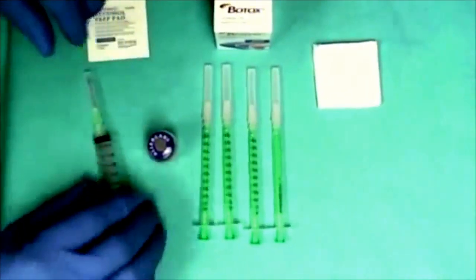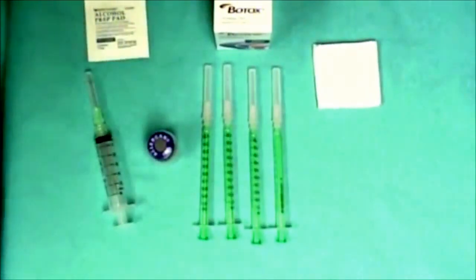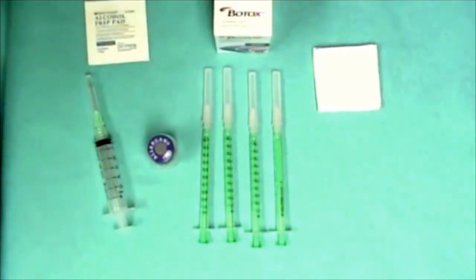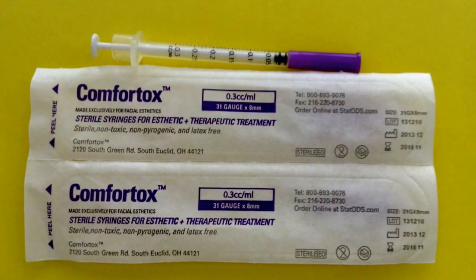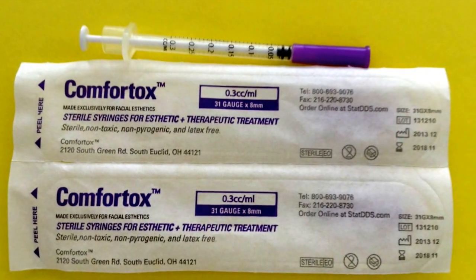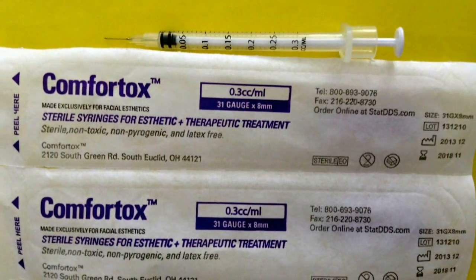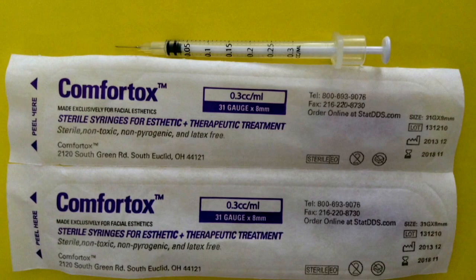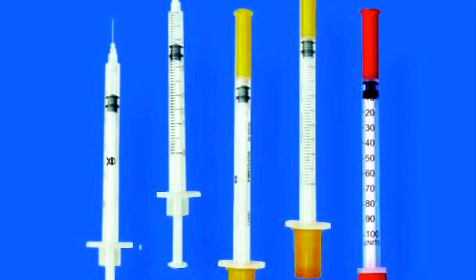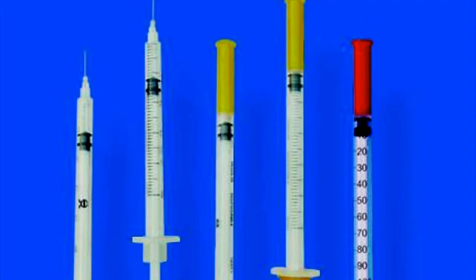Now you can either remove the original mixing needle from the vial if you use syringes that are one single piece with the needle attached, or you can leave this needle and use luer lock individual syringes of 1 cc to aspirate the number of units desired for the use you are about to proceed.